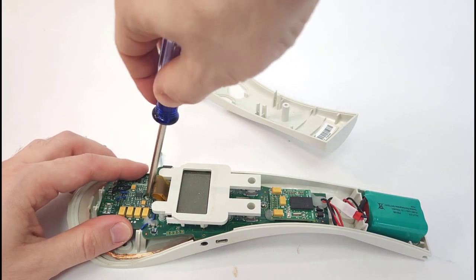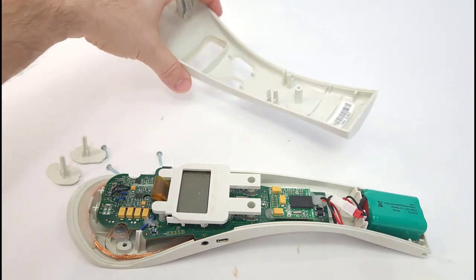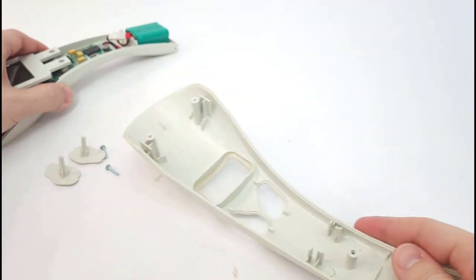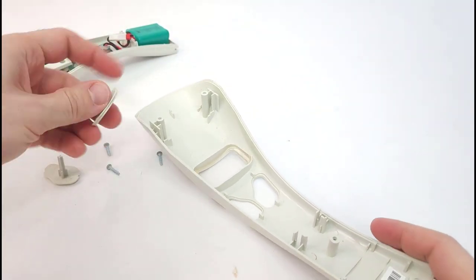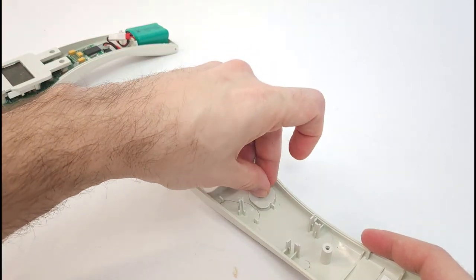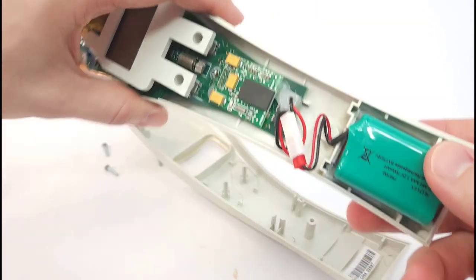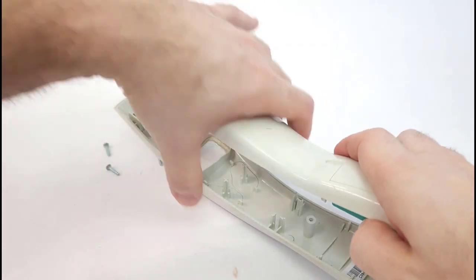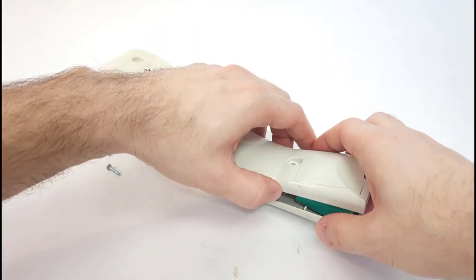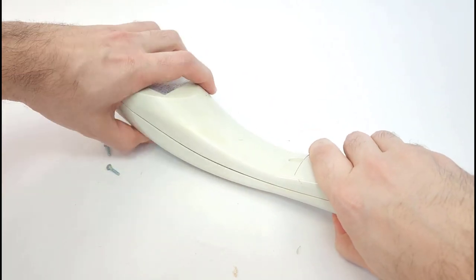And then here is the final tricky step to putting this back together. Remember earlier in the video, if you flip this upside down, the buttons fall out. So to put it back together, you actually need to put this side face down, put the buttons in, and then gently lower this half on from the top, which is a little annoying because now the battery wants to fall. Put the back half of the case on, and you'll have to be careful with the battery positioning or else it might not close all the way.